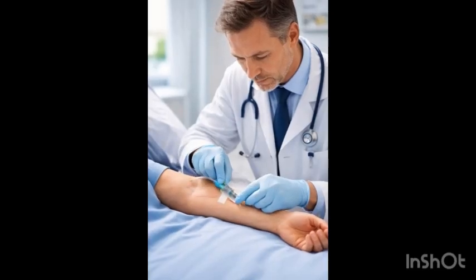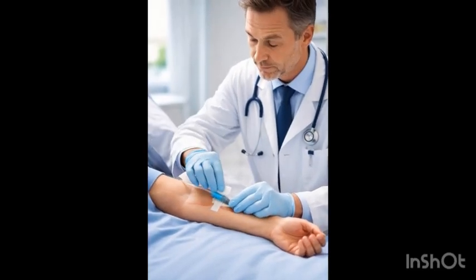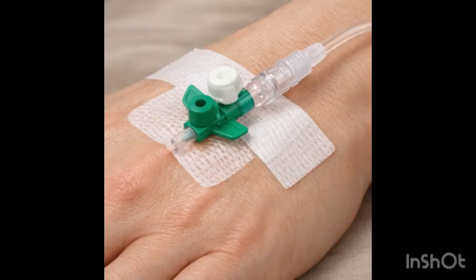Okay, today we are discussing IV cannulation. So, why do you need an IV cannula? It is a short-term direct access into the vascular system. We can use that to give IV medication, IV fluid, and blood products. And also, we use an IV cannula to give IV contrast for diagnostic imaging.